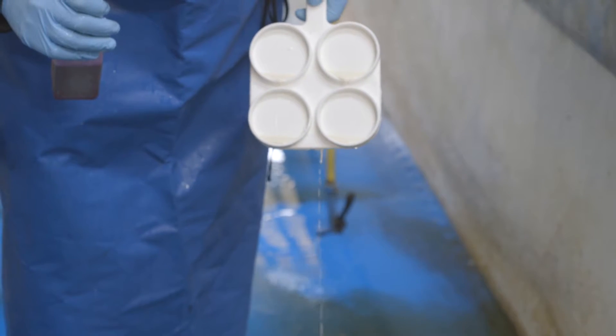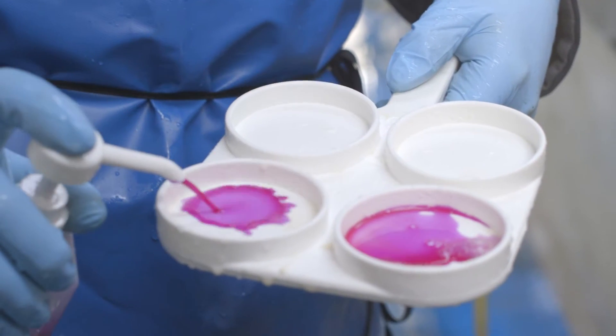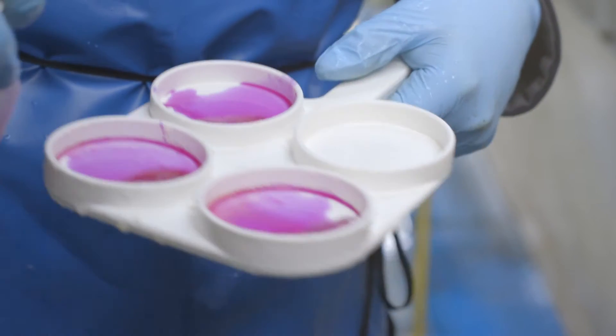Pour out the excess milk down to the marker line in each of the wells, add in equal amounts of CMT solution to each well of the paddle.